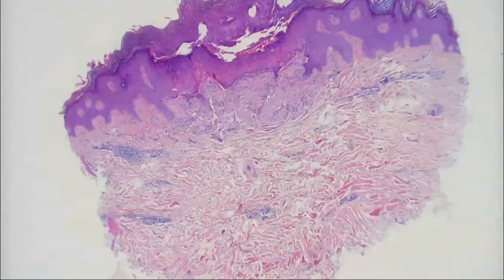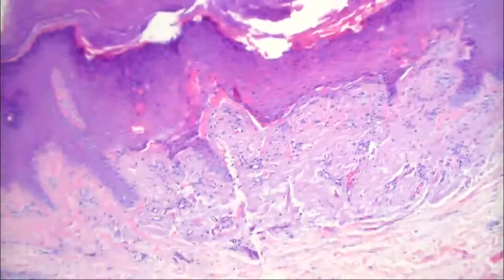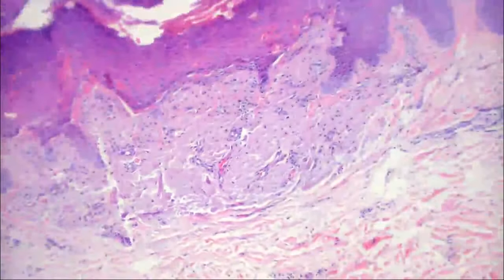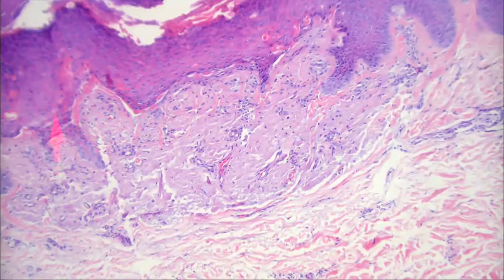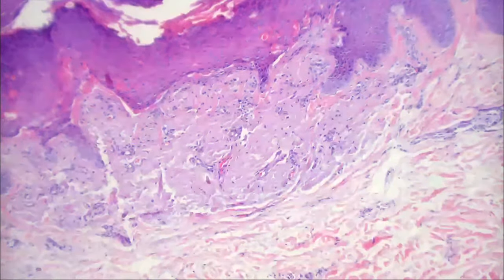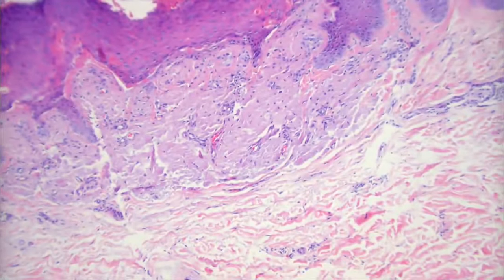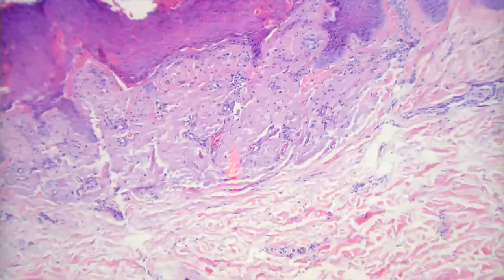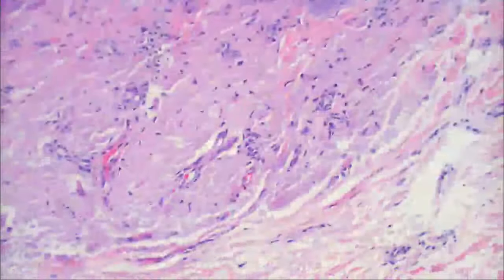And then there are a couple of things here that are kind of striking: the presence of these keratotic cells in the epidermis. Yeah, quite a few of them. And then the other thing is right down below in the dermis. This area or down in this area? No, the first one. The first one? Yeah. This area, okay. That has a distinct color and a different pattern of collagen or whatever that is. Is this collagen? I wasn't entirely sure. First, I thought it was like deposition, but I wasn't sure. It didn't have exactly the same appearance.